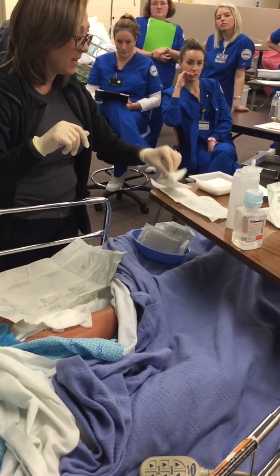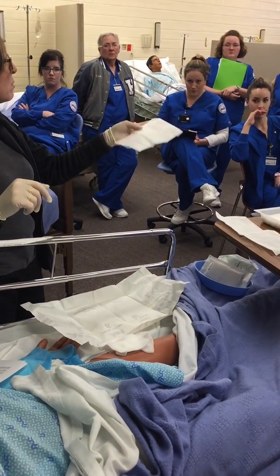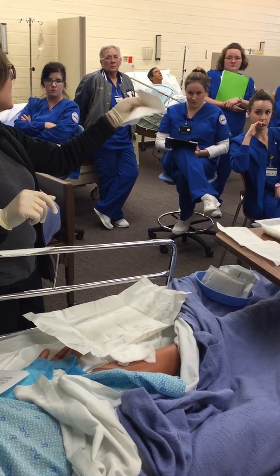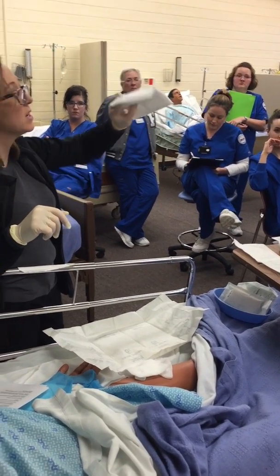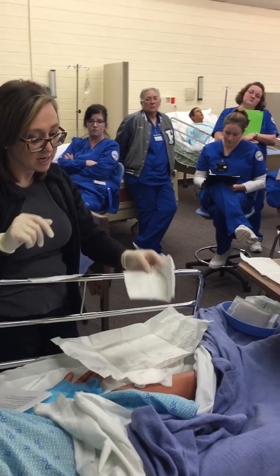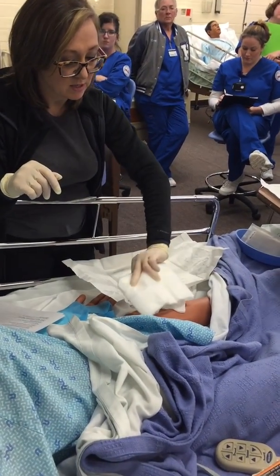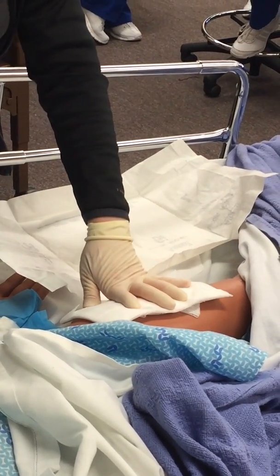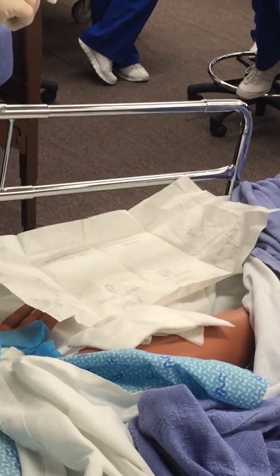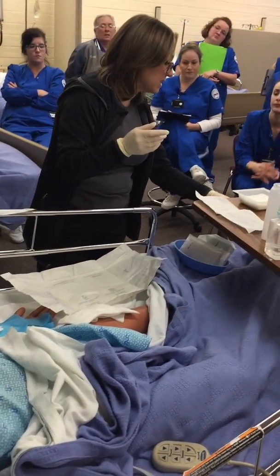And then I want my ABD pad. This should be the final thing you put on there. Is the blue line up or the blue line down? Blue to the sky. Anytime you see blue usually in medical, it goes up. Okay, so blue line to the sky. I'm going to place this directly over the wound because this is what's going to absorb most of that. Put this in place. I still have a sterile hand. Do I need to be sterile anymore? No. Not really, because all I'm doing is placing tape on there.